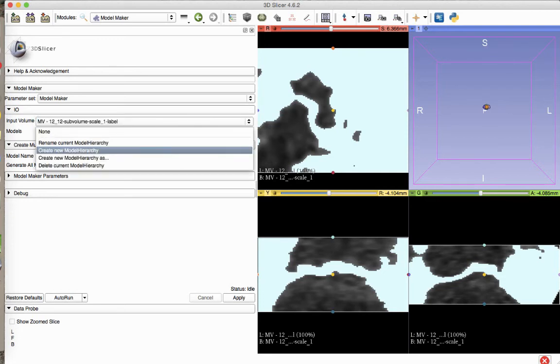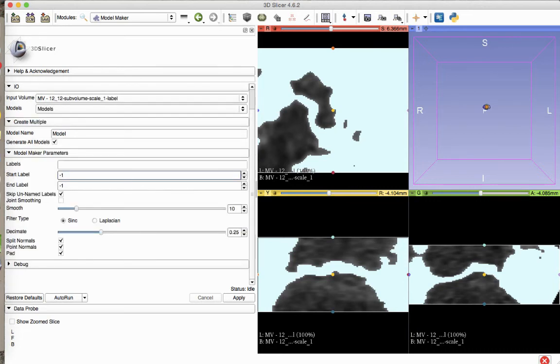In the Models drop-down menu, select Create New Model Hierarchy. A downside of thresholding ultrasound datasets is that some artificially abrupt edges can be created. The Smoothing tool helps remove these edges and minimally alters the overall geometry of the model.